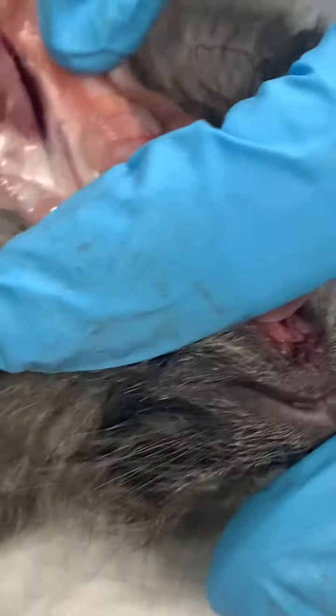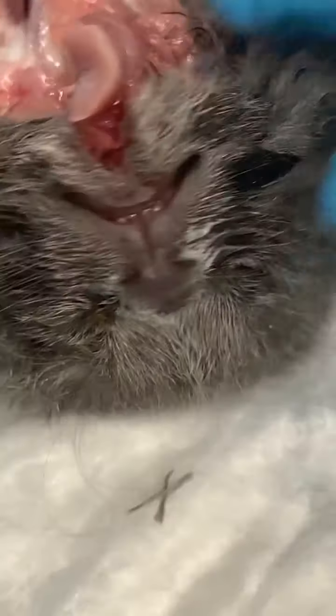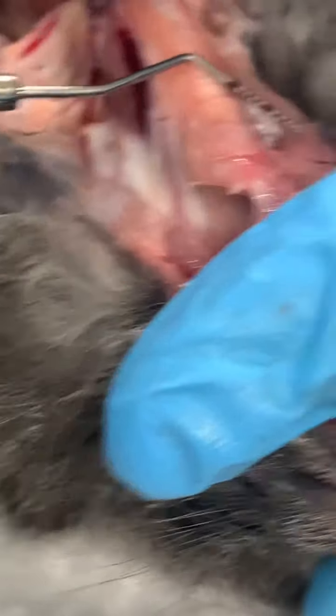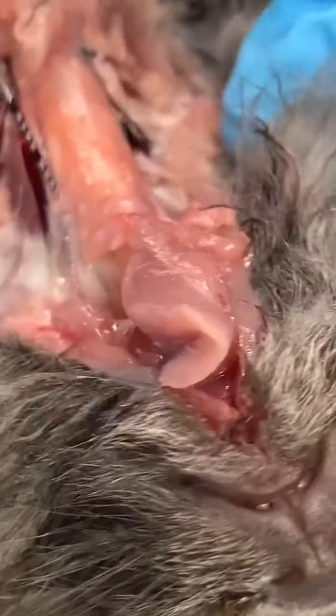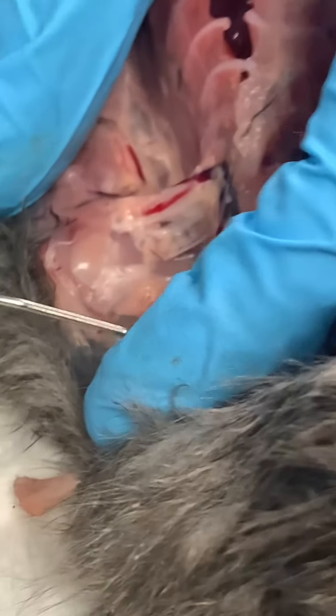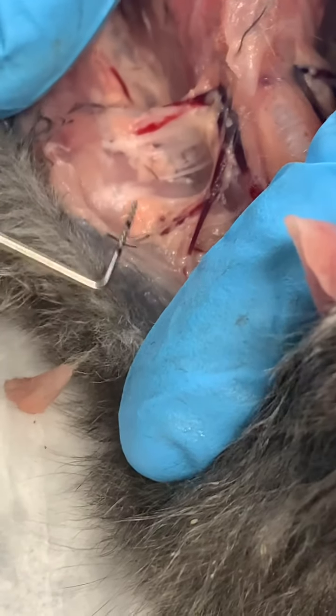And then as far as lymph nodes, our mandibular are these structures right here. Our superficial cervical lymph nodes, there's one there.